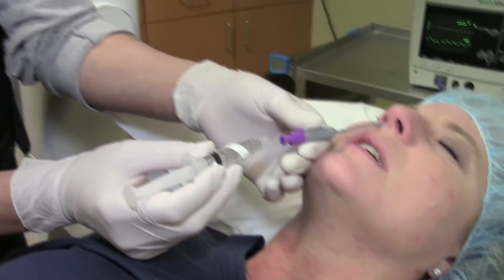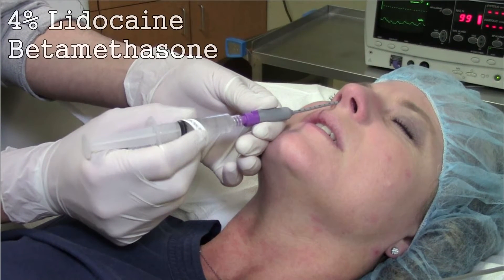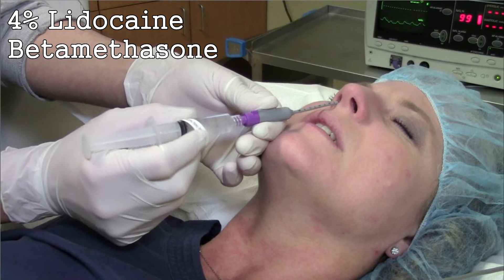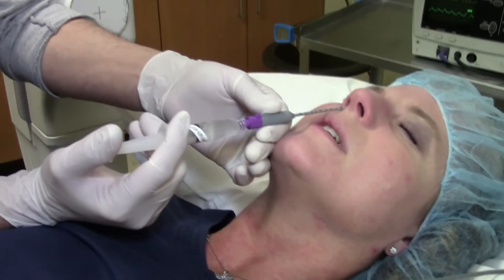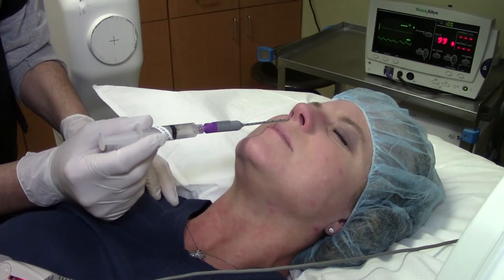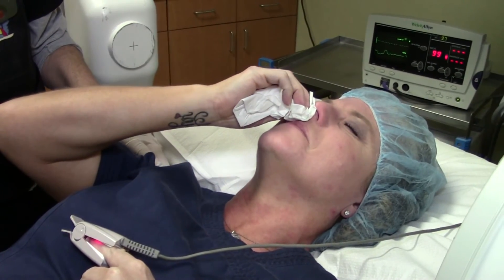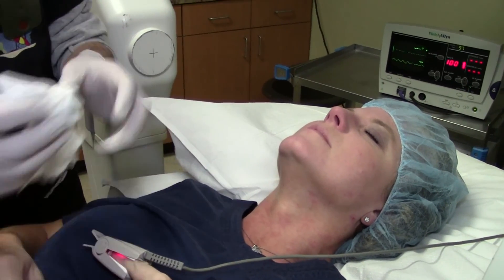I am now going to connect the syringe that includes 4% lidocaine and 3 mg of betamethasone, and I am going to administer 2 mLs of the injectate. We will repeat the same sequence on the other side, performing this treatment bilaterally.